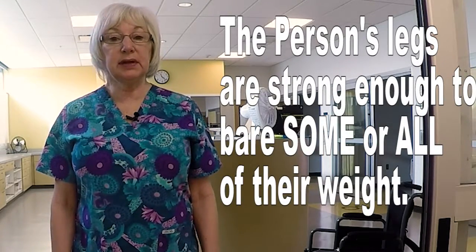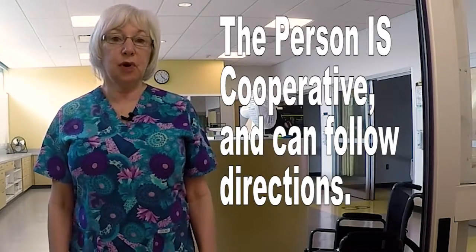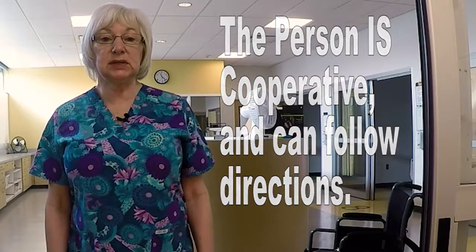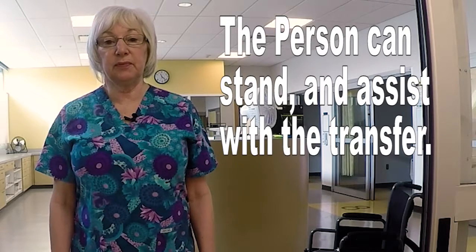I am going to demonstrate how to transfer the person from a bed to a wheelchair. Some persons are able to stand and pivot. They may have difficulty walking, or maybe they cannot walk, so they use a wheelchair for mobility. A stand and pivot transfer is used if the person's legs are strong enough to bear some or all of their weight, the person is cooperative and can follow directions, and a person can stand and assist with the transfer.